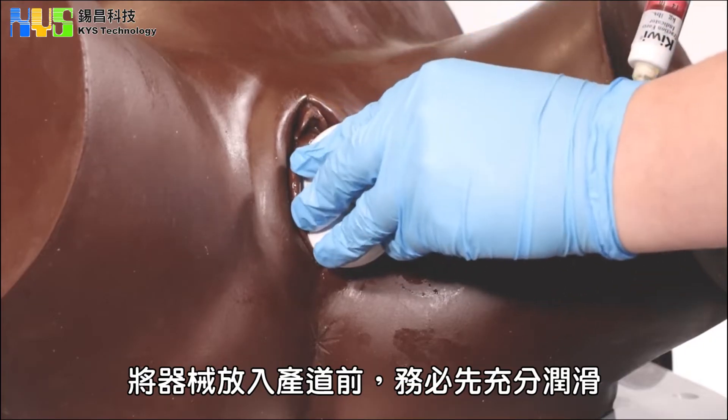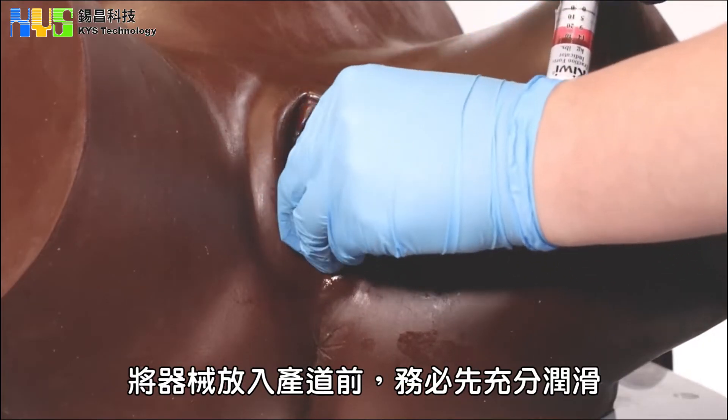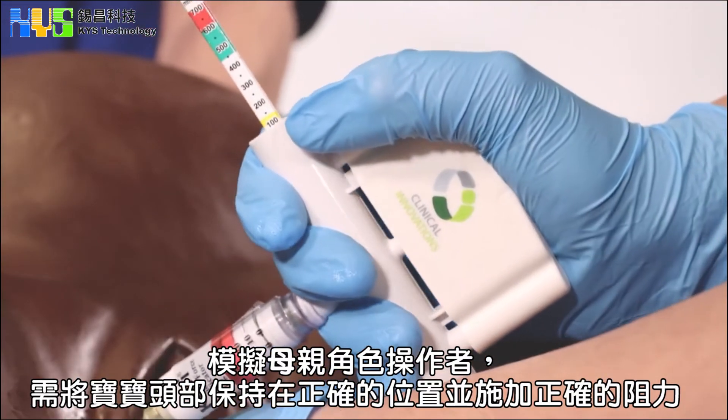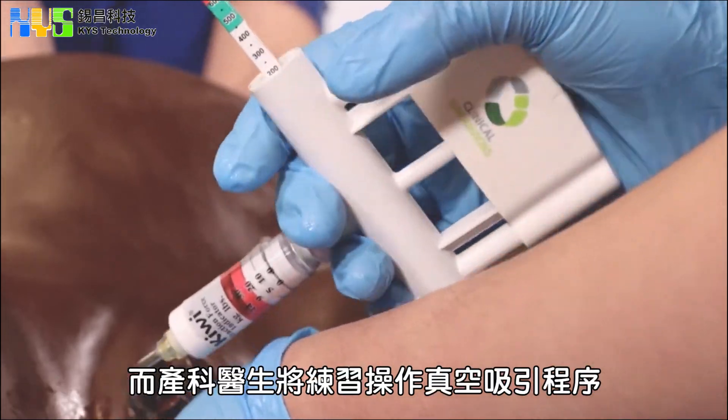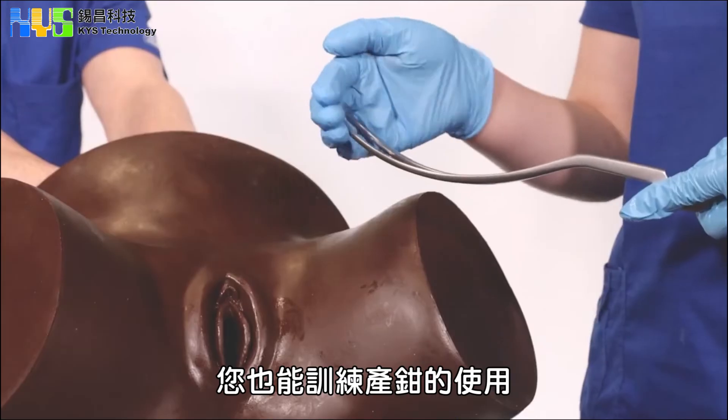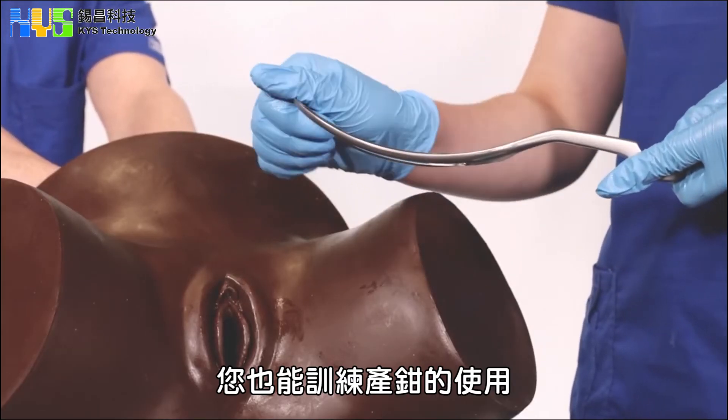Please ensure the cup has been lubricated prior to being inserted into the vagina. The mother will hold the head in the correct position and apply the correct amount of resistance, whilst the obstetrician will follow the recommended instrumental delivery procedures. You can also simulate the use of forceps.